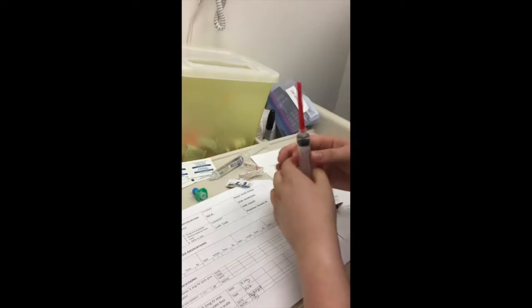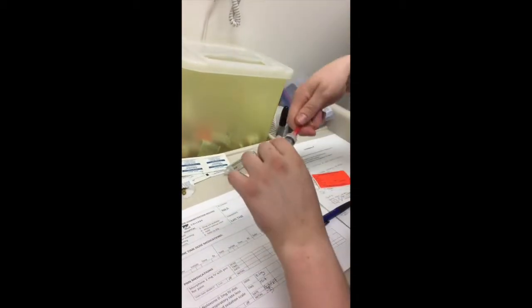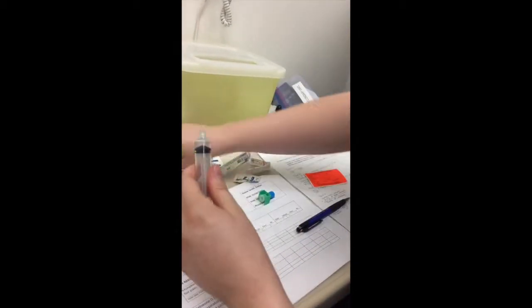Now I need to properly dilute this. So I need to attach it to this little guy.